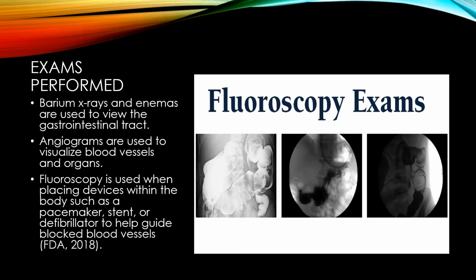Fluoroscopic exams can be performed in interventional radiology, X-ray, CAT scan, catheterization lab, and the operating room. When it comes to the cath lab, there is a cardiologist and cath lab technologist who uses fluoro to visualize the arteries of the heart and chambers of the heart to treat any stenosis or any abnormalities detected. Catheters can be used instead of surgery when accessing blood vessels.